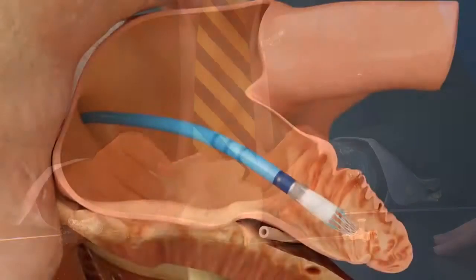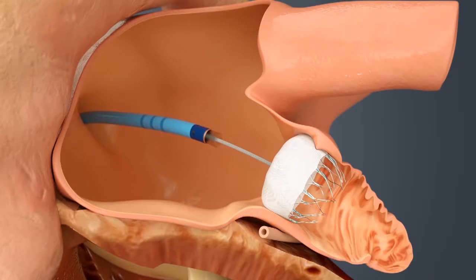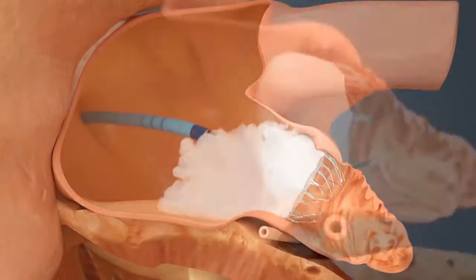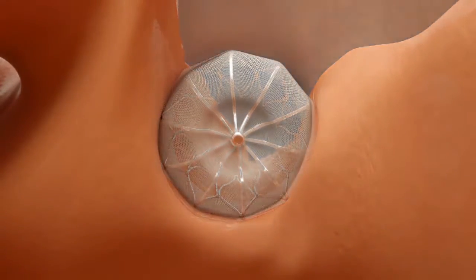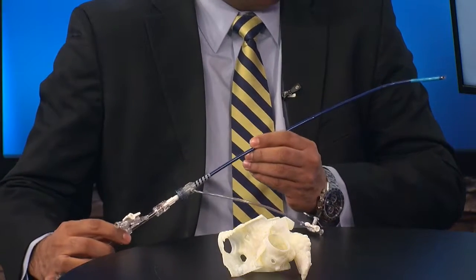And this is also with a catheter. You do this. Correct. It's a catheter-based technique where we bring the patient into the cath lab. This is typically done while the patient is on a breathing tube on a ventilator. Then we make a little incision in the vein in the leg and advance this catheter all the way up to their heart. We are on the right side of the heart, then we make a tiny hole in the heart to cross over to the left side.